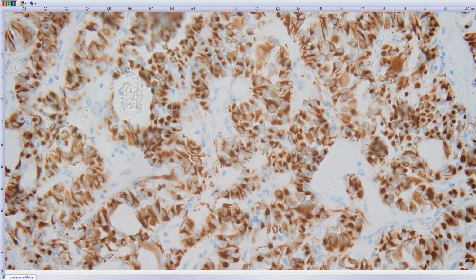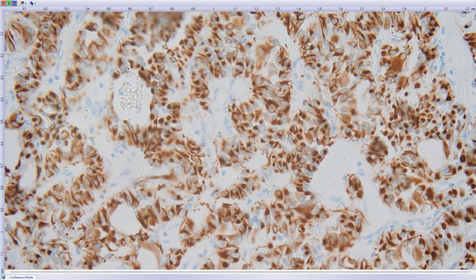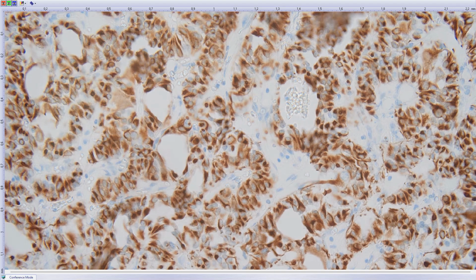And in other settings, you always have to perform immunohistochemistry, and clinicians should rule out syndromic association. So these cauda equina paragangliomas, or the new term, cauda equina neuroendocrine tumors, are never associated with any kind of syndrome. And in fact, also by methylation profiling and immunohistochemistry, these are completely different tumors.